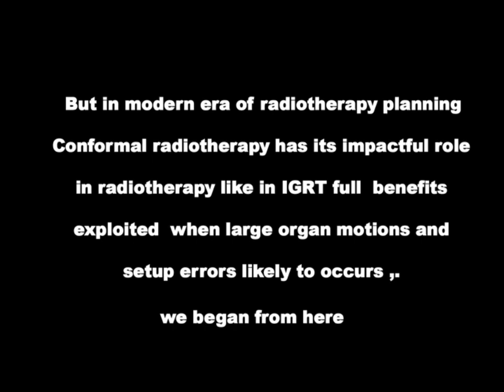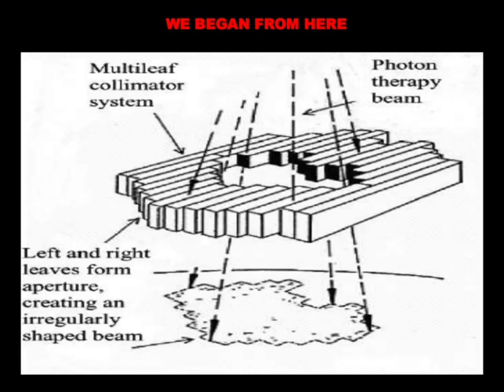But in the modern era of radiotherapy planning, conformal radiotherapy, like image guided radiotherapy, has a very impactful role. Its full benefit is exploited when large organ motions are there and setup error is likely to occur. We begin from here.